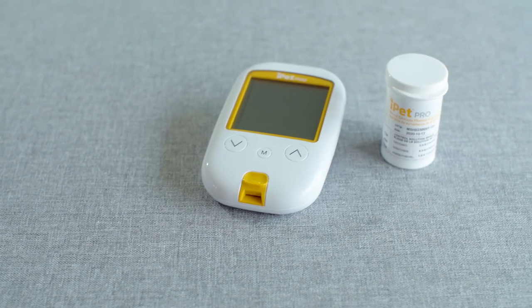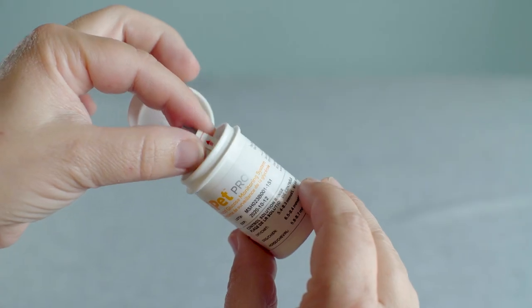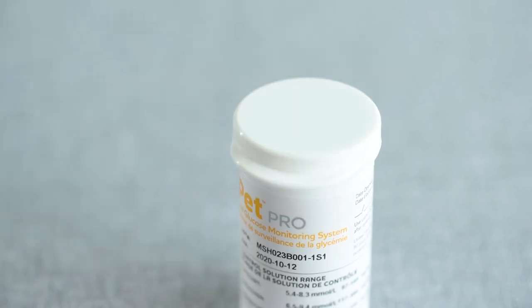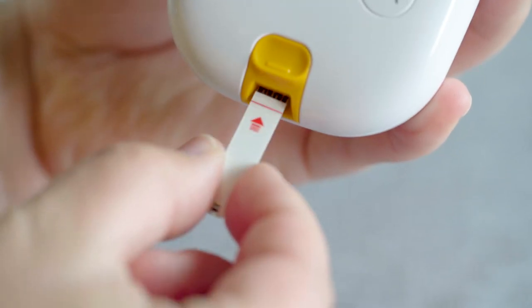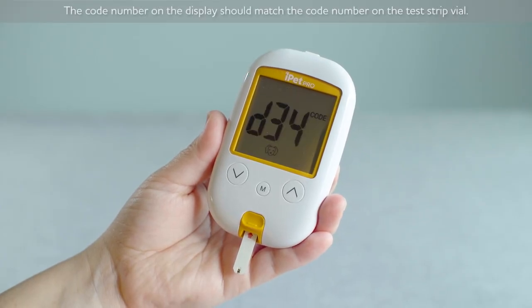A control test is recommended for the following scenarios. Begin by inserting the contact bar end of the test strip into the meter, being careful not to touch the target area where the control solution is drawn into the test strip. A flashing droplet icon will appear, confirming the meter is ready for testing.